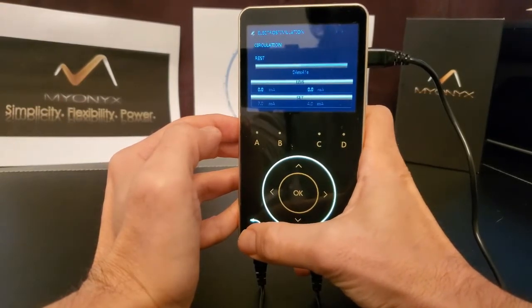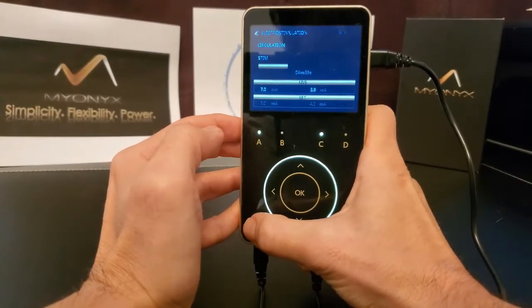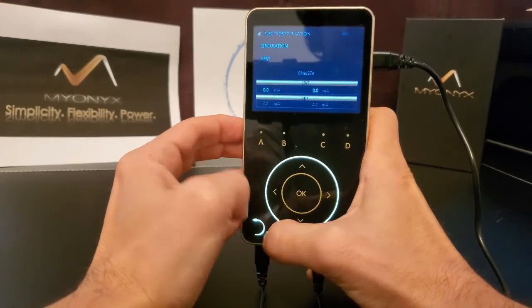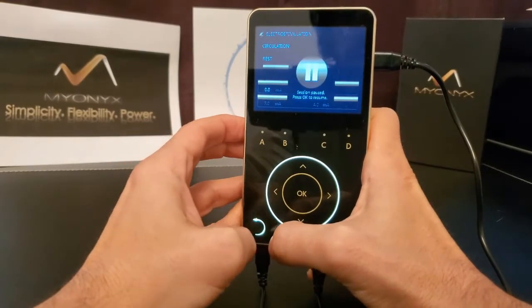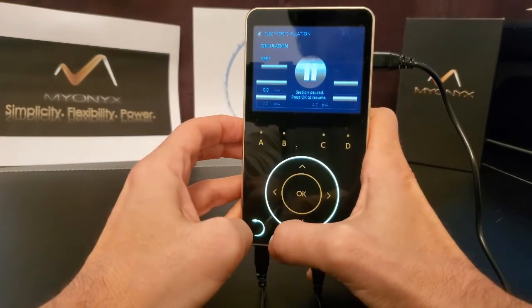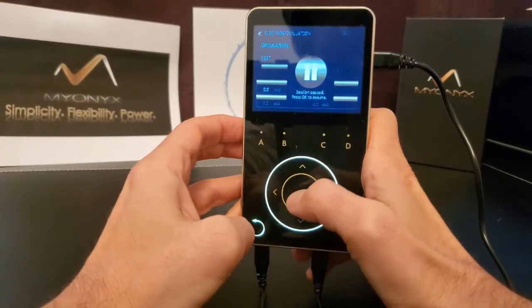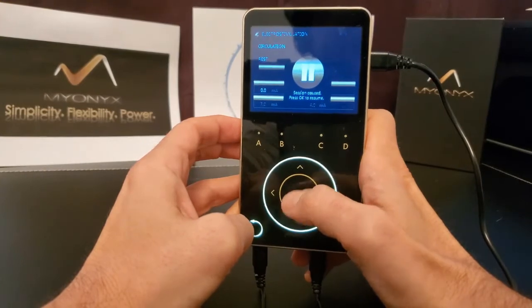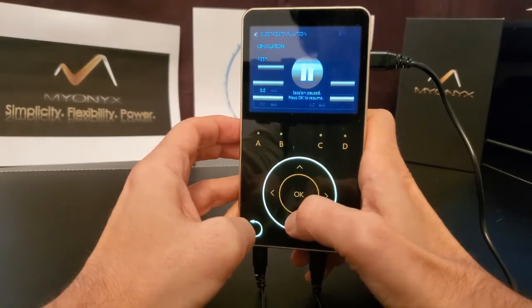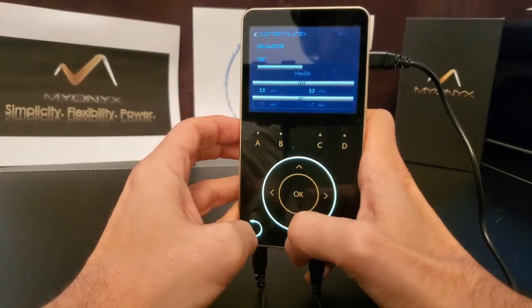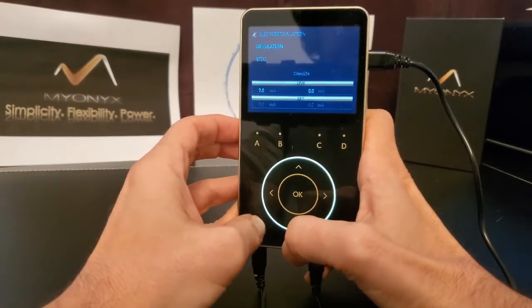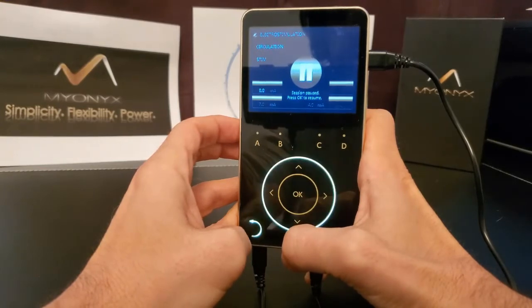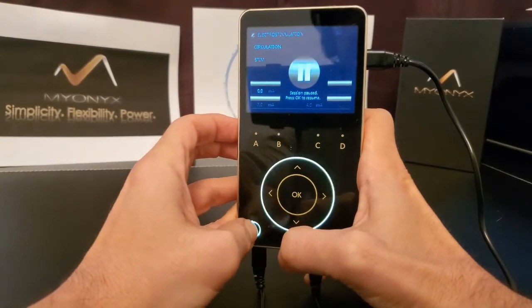To pause a session, click the back button. Once in pause, you may resume the session by clicking OK, or stop the session by pressing back again.